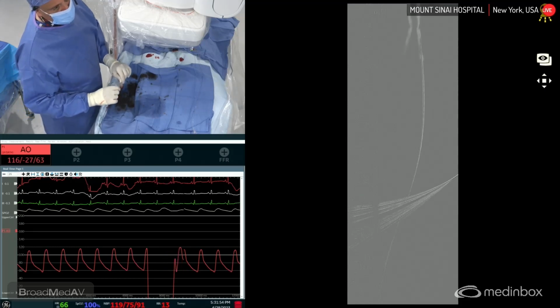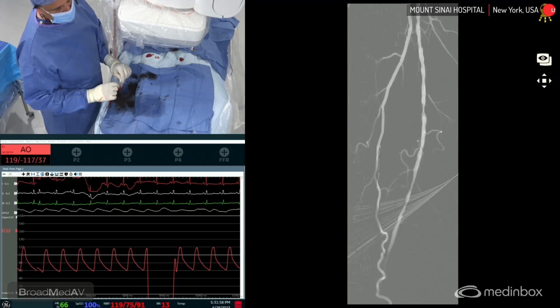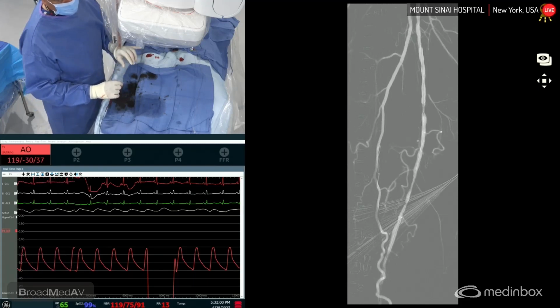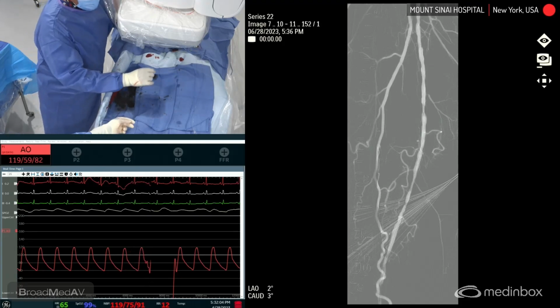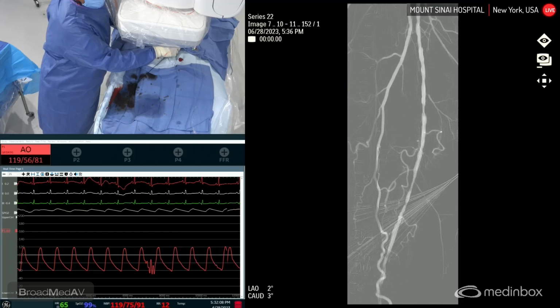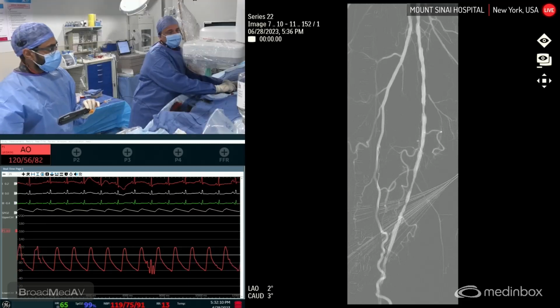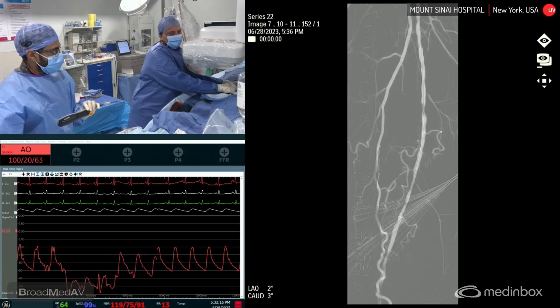And for those of you who are from the beginning, you see how the flow is so different now compared to before. You know, the flow is much, much better. So we're just going to cut from the first lesion down. This is not vessel beautification. So I'm not too concerned about making this vessel look gorgeous, because we know that the longer, more lesions I touch, the likelihood of the more my restenosis is going to be.